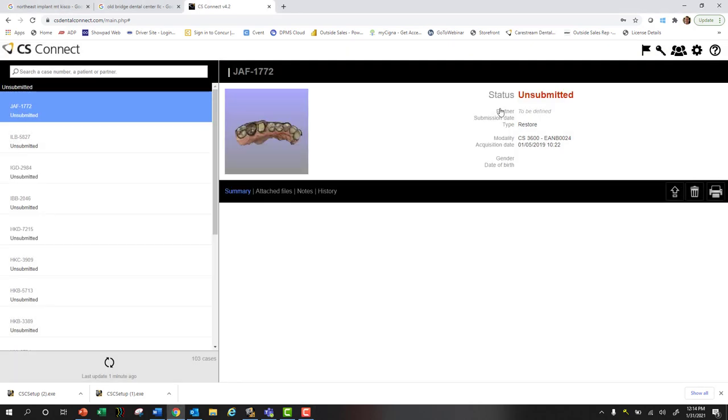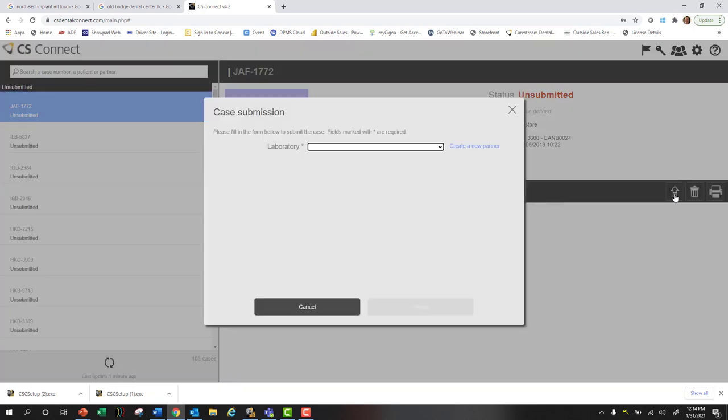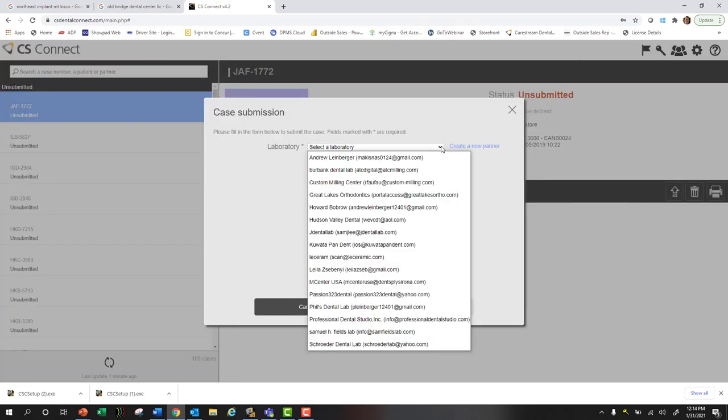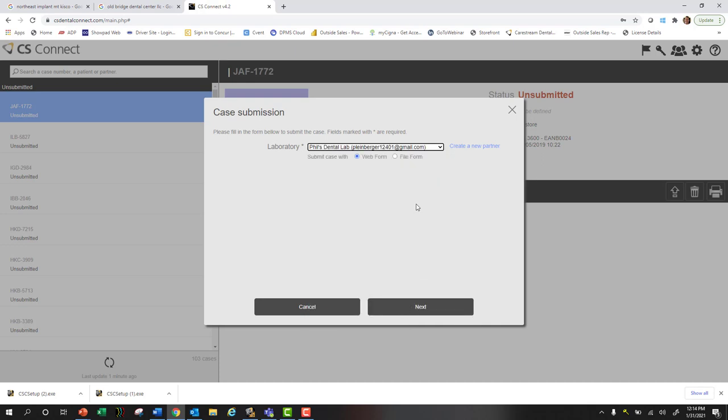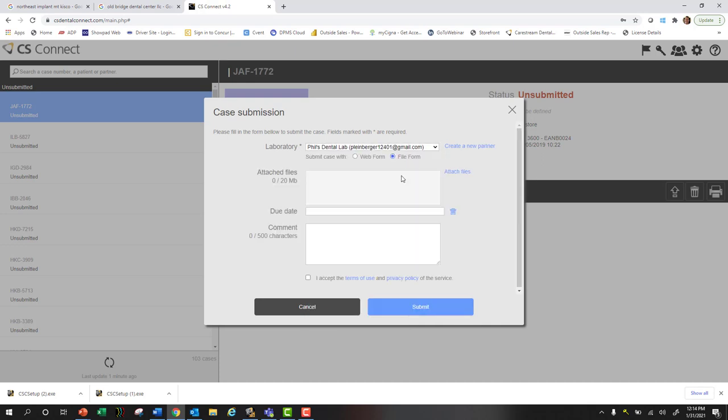Once that lab accepts and creates their own lab account, then you can actually send them the case. You're going to hit submit and select from the list which lab you want to send it to. We're on file form.